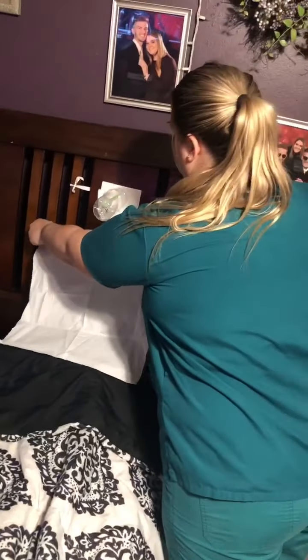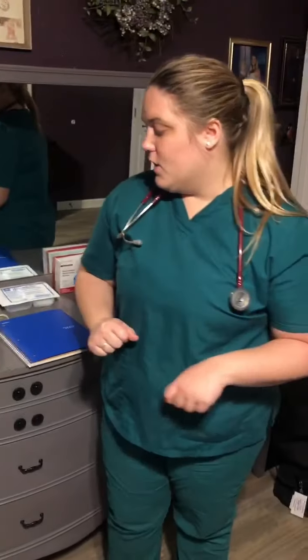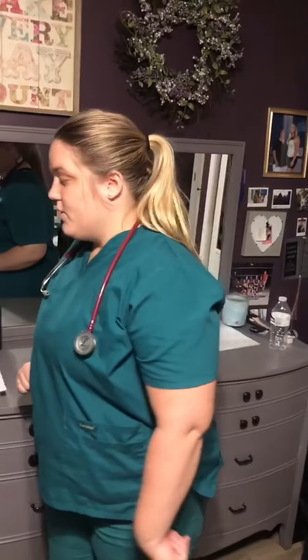So this is just a clean drape. And then after that, I am going to put on my PPE. So now that I have my PPE on, I'm going to go ahead and start the procedure. So I am going to make sure my patient is in high Fowler's or semi-Fowler's, and if they were unconscious, I could turn them laterally towards me. And then I would explain the procedure to the patient.